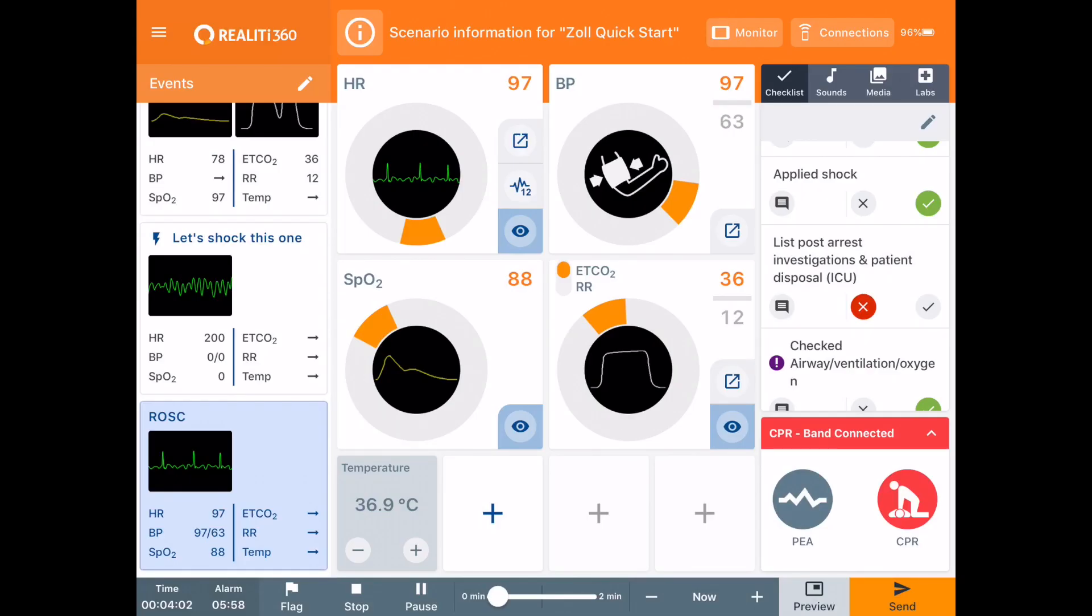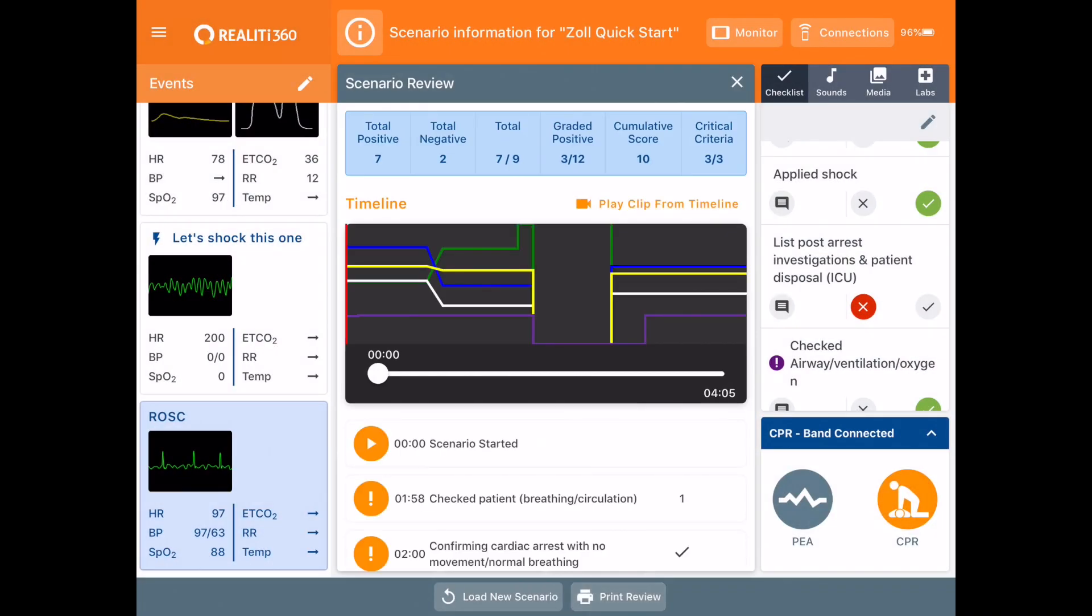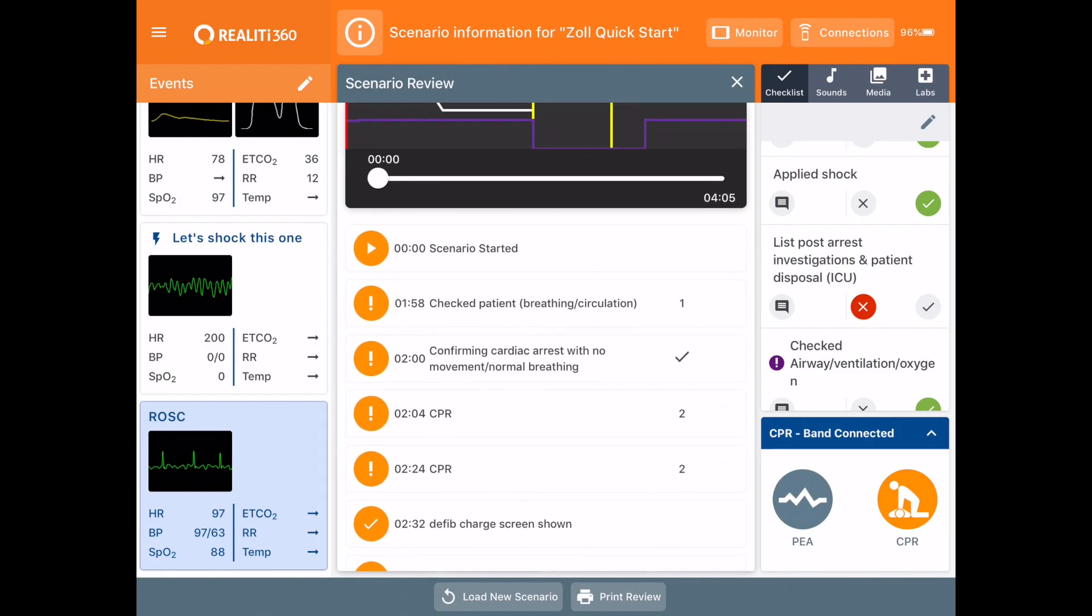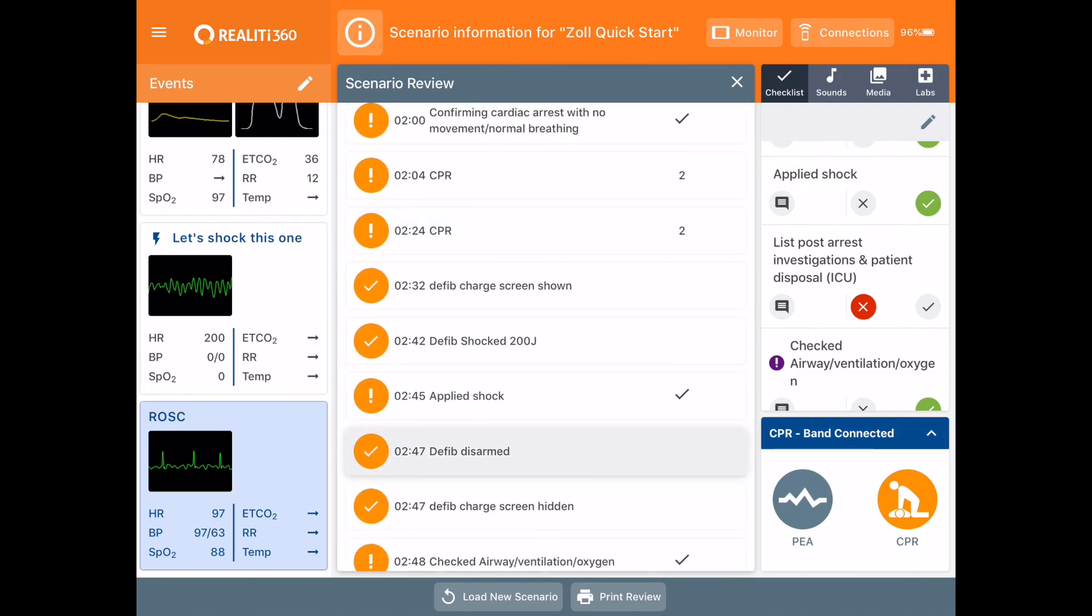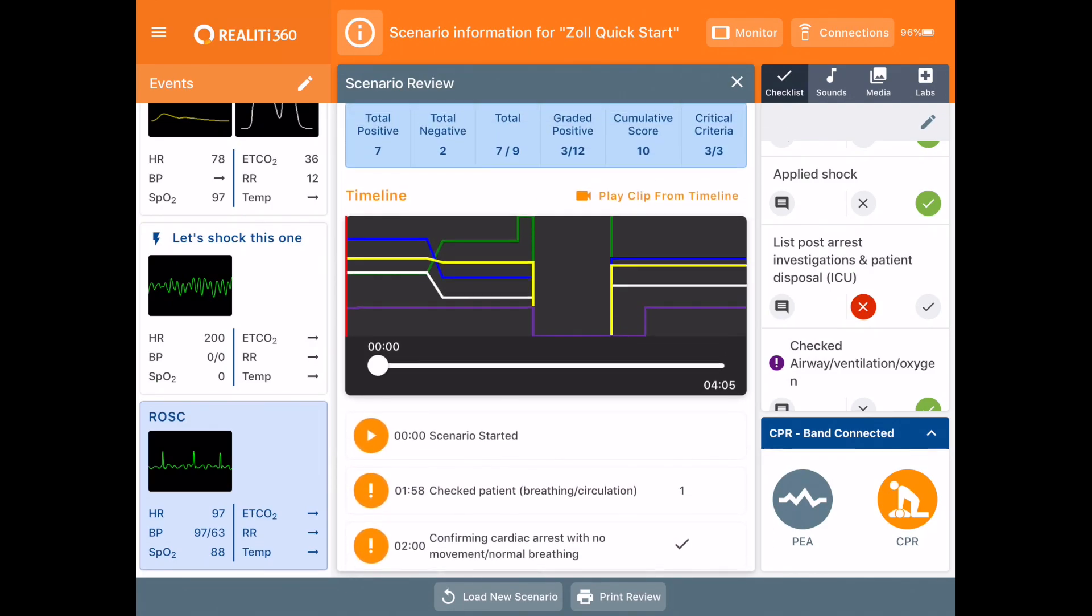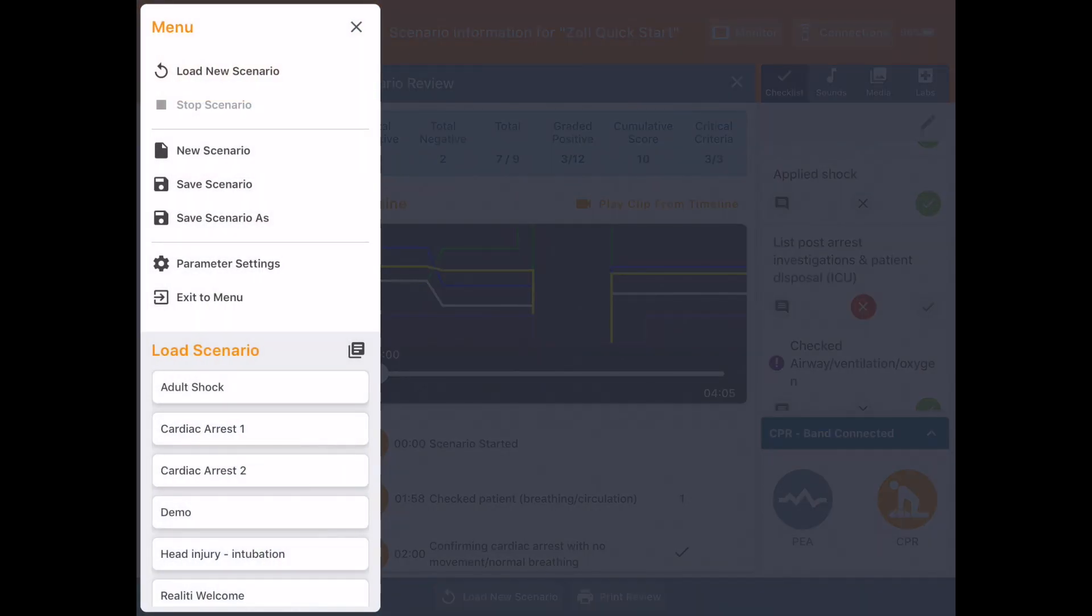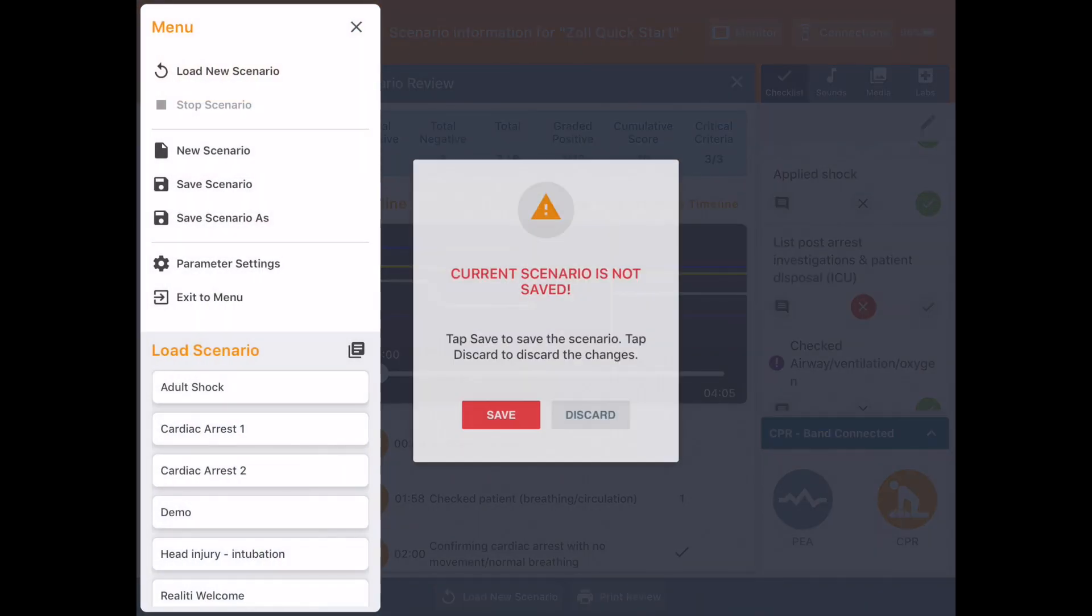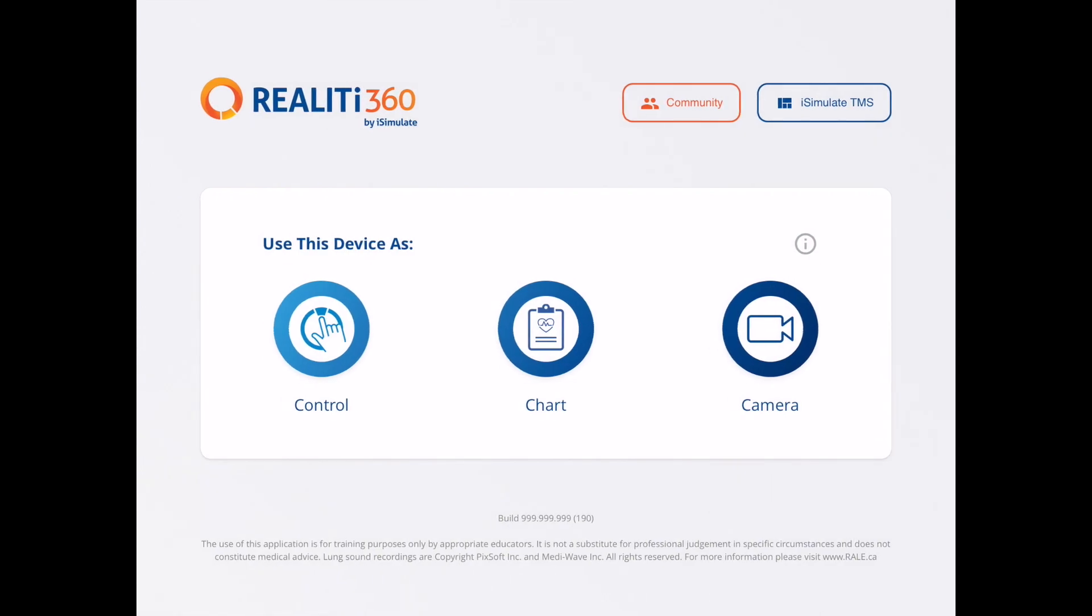So I've just finished running my scenario, so I'm just going to press stop. And now I'm presented with our normal scenario review which you can see all of the vital signs there in a graph and all of the checklist items and events that have happened. But this time I'm now going to press the menu button, exit to menu, and now I'm back to the home screen and now I'm going to jump into the iSimulate TMS.